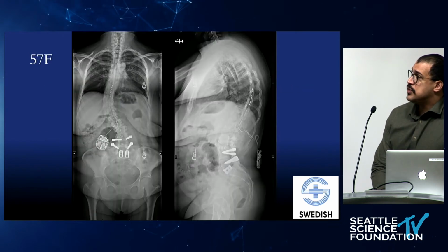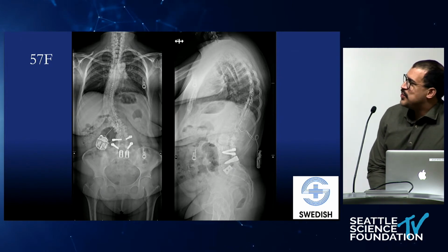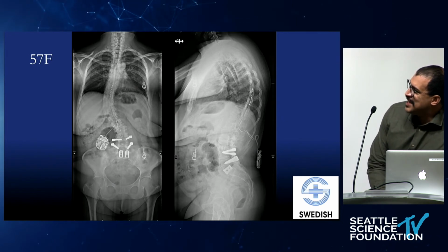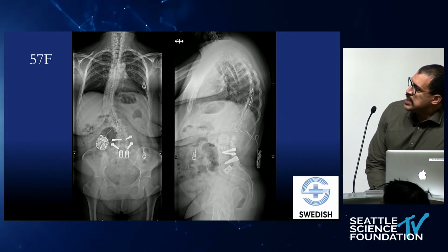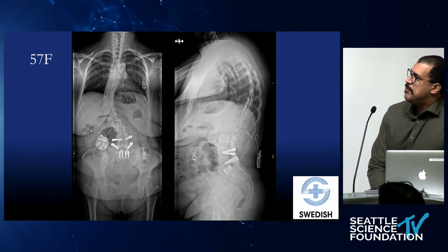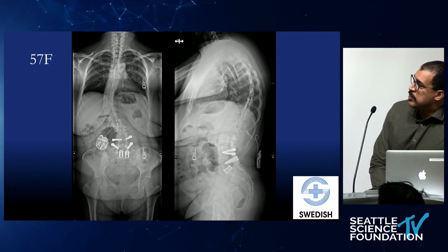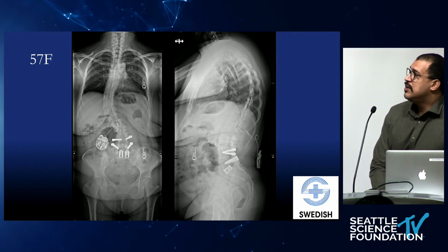It's a challenging surgery. So this is another woman who came to me. I don't know if you can see that well, but she has dynamic stabilization. She's got those old, I think they're KT cages. She's had lots of spine surgeries. The surgeon did a standalone lateral above that prior dynamic stabilization, which gave her a few months of relief. That was a left-sided lateral with the peek cage there. The plan was to come back and do an additional right-sided standalone lateral above the previous standalone lateral.